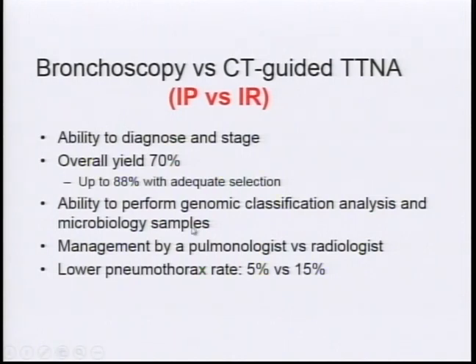In addition, we normally use a cytologist in the room while we're doing these biopsies, and we get some feedback of what we're getting. If they tell us that they're not seeing any cancer in the lesion that we get, we can apply this gene test on airway mucosal cells, and that allows us to figure out what to do down the line.